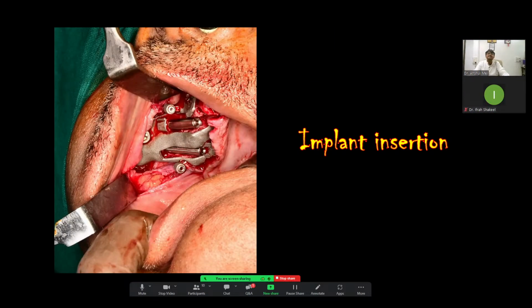But in this, when we planned it, we knew that 52 and 60 degrees are available from the company, and we have different angles. It does not permit us the 52 and 60, as well as the correction is not in one direction, it is in two directions, buccolingual as well as mesiodistal, because anterior implants have both mesiodistal and buccolingual angulation. And from the company only a one-angle abutment is there, so I can only correct one angle. So that's the problem we noticed.